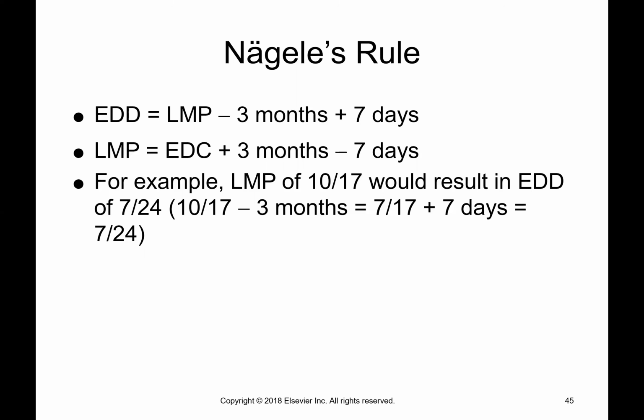Granted, you don't have to figure this out by yourself because we have computers that you put the LMP into, and then it will calculate the estimated due date for you. So this is just more an interesting little tidbit because you will be able to get it calculated, and our machines do it. So I'll show you how to do that.